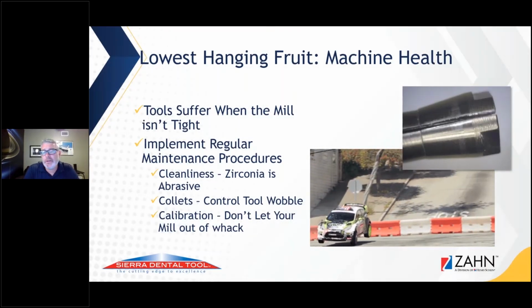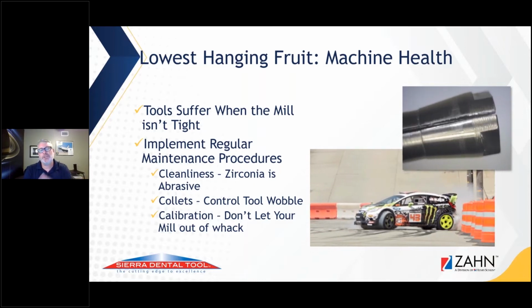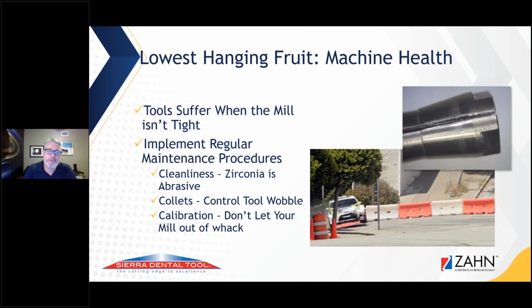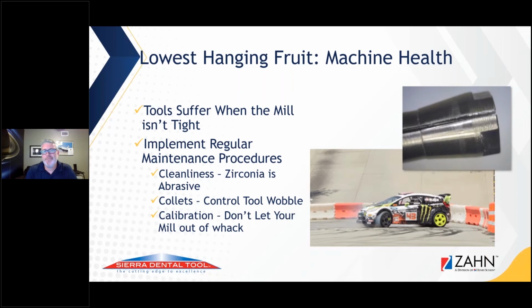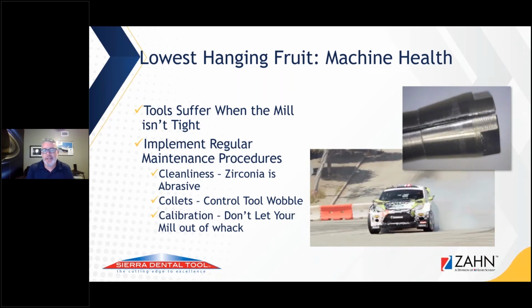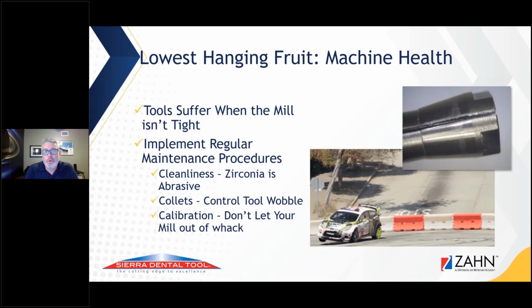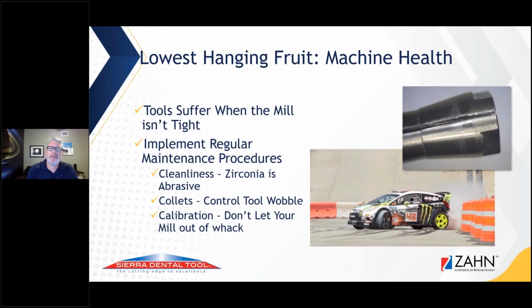Big thing here is the machine health. That's what we call the lowest hanging fruit, because if the machine isn't clean and maintained, you're going to get poor restorations off of it. So the tool itself ends up suffering from the machine being neglected in service, being neglected in keeping clean, calibrated. As we all know, zirconia in a dust environment is super abrasive. And I'll show you some examples of what it does.